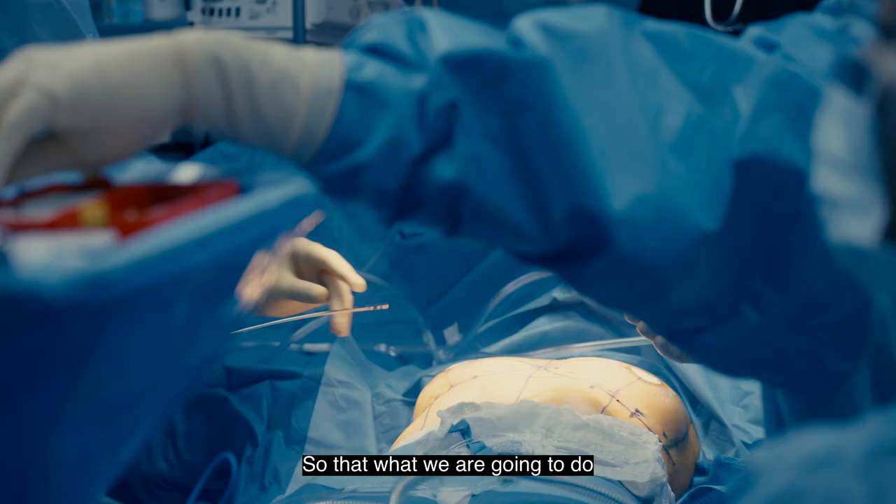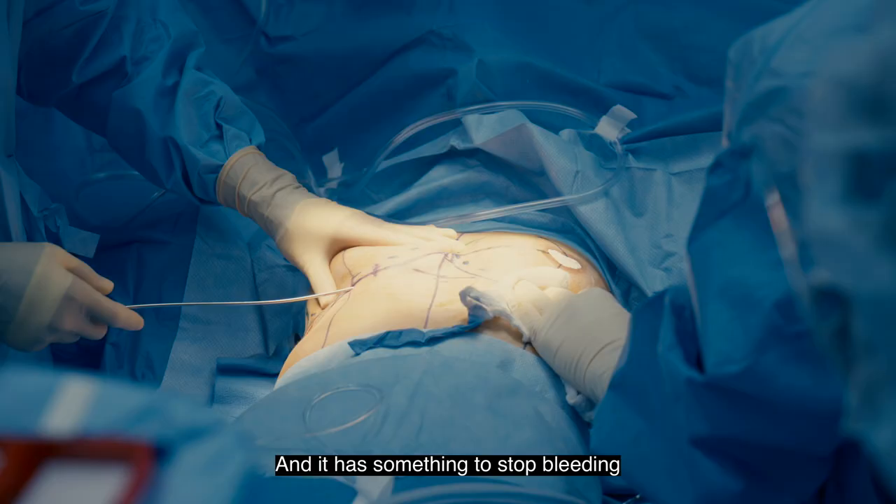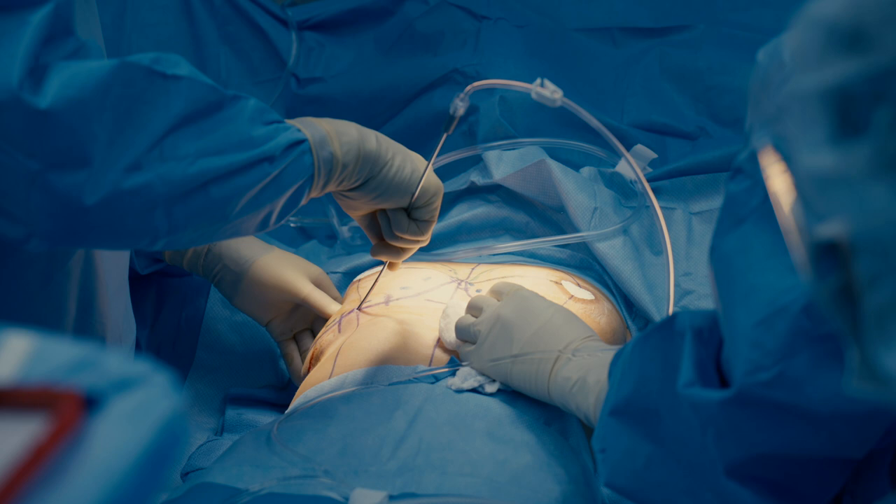Now we're going to put numbing fluid in with antibiotic and something to stop bleeding. This helps decrease a lot of pain postoperatively. A lot of my patients after breast augmentation do have pain, but not as much as you'd expect, because we put in numbing medicine and block the nerves the best we can.